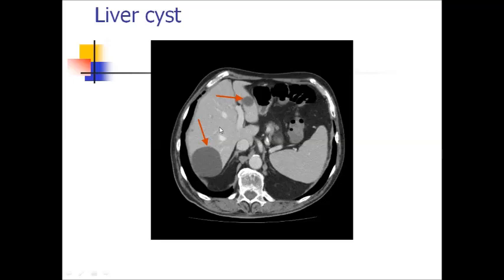the surrounding liver parenchyma, and from the parenchyma of the spleen at the same level of examination. The density of fluid, the density of water, may be measured, and if it is about 0 Hounsfield units, you may say that you have confirmed the diagnosis of cyst, and of course smooth and regular contours.